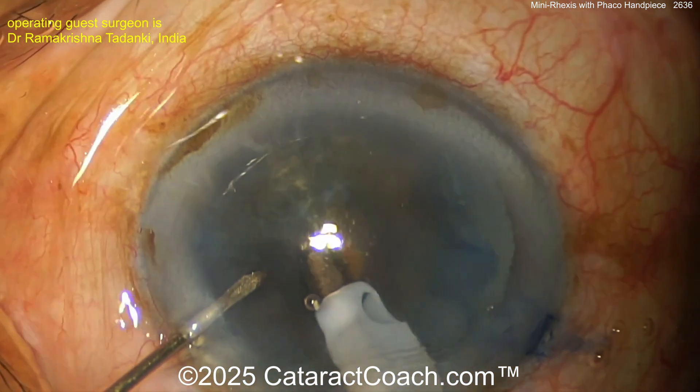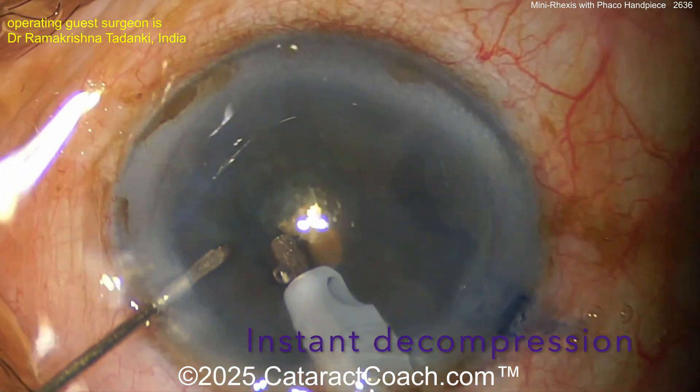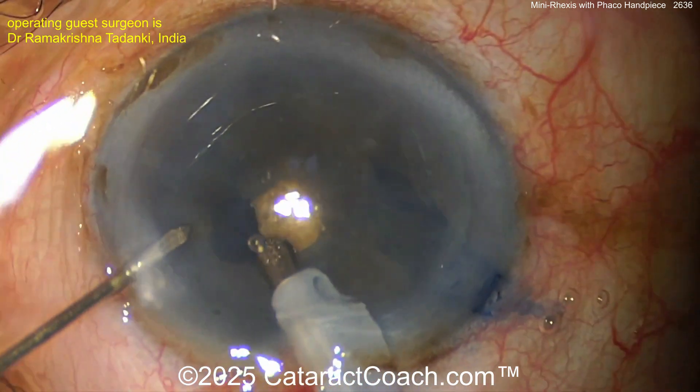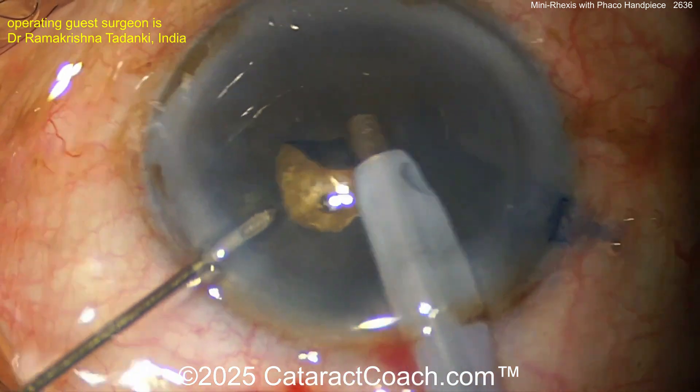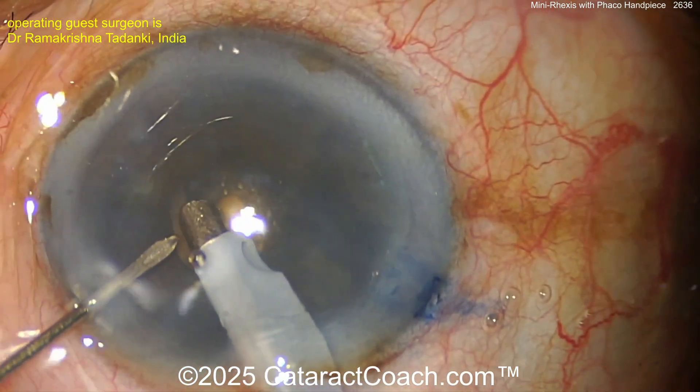A small needle is used to puncture centrally — there you go, puncturing the capsule. Once you get a small flap, you use the vacuum with foot pedal control to decompress the bag first.